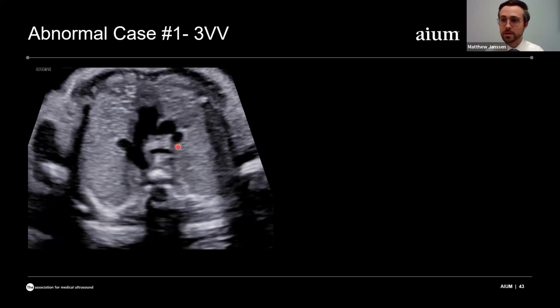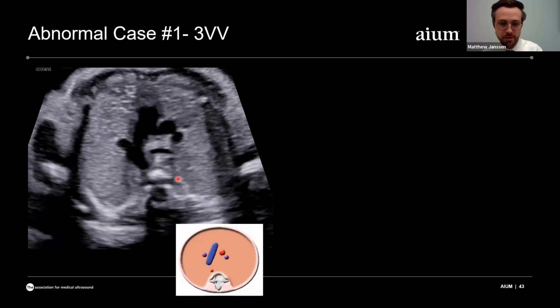But again, we're going to continue down this pathway. We're not going to jump right to the diagnosis or anything. And we say, well, what's the size relationship between them? And certainly it seems like, at least from this vessel on, that the size progression is what we would expect. And that also calls into mind, well, which one of these is the abnormal vessel? And so, if this is the size progression we would expect, then maybe it seems like this one over here is the vessel that is abnormal. And so schematically, this can be shown here from the same paper that I discussed before, just to highlight that pattern recognition of seeing that fourth vessel on the side.